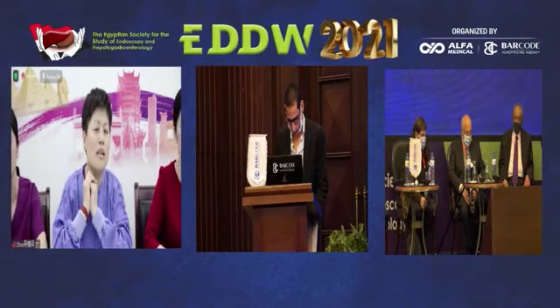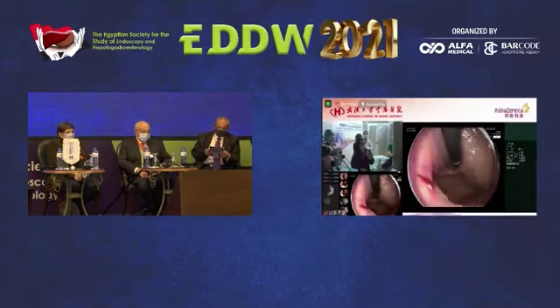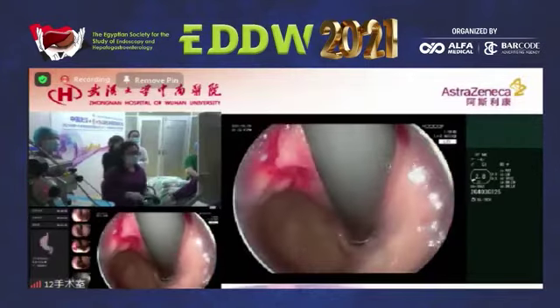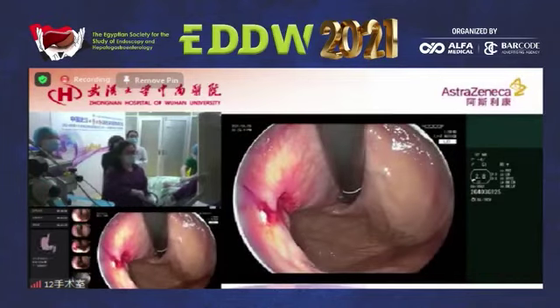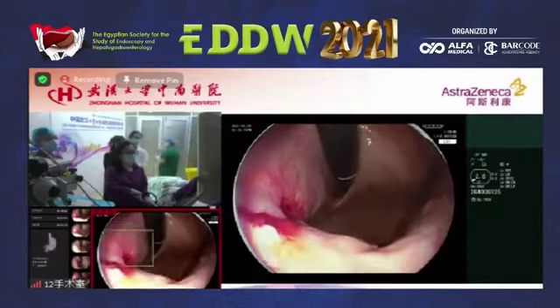Thank you. Do you think this is a tumor? Yes, I think it's a tumor. Probably it's an undifferentiated cancer. I will take a deep biopsy.